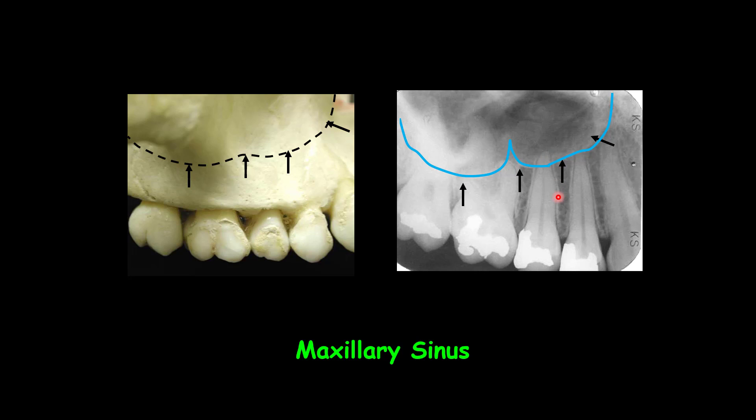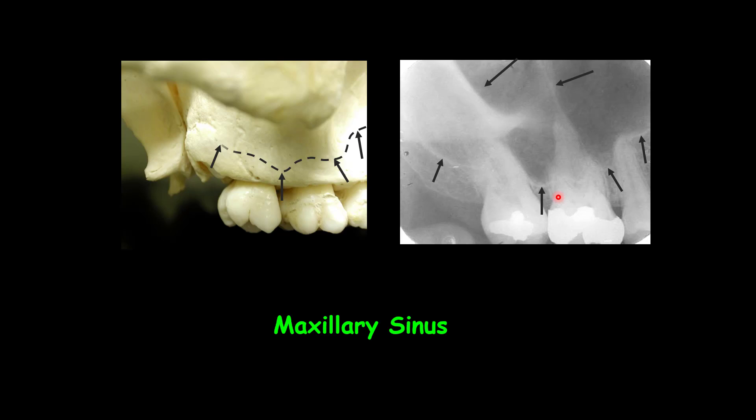Mostly when loss of the posterior teeth occurs, the sinus floor may expand further between the teeth, so you will see this kind of up-and-down appearance in practical imaging. It looks as if the roots are projected into the sinus cavity, but there is a thin layer of bone covering the roots — a fusion between the lamina dura and the floor of the sinus.